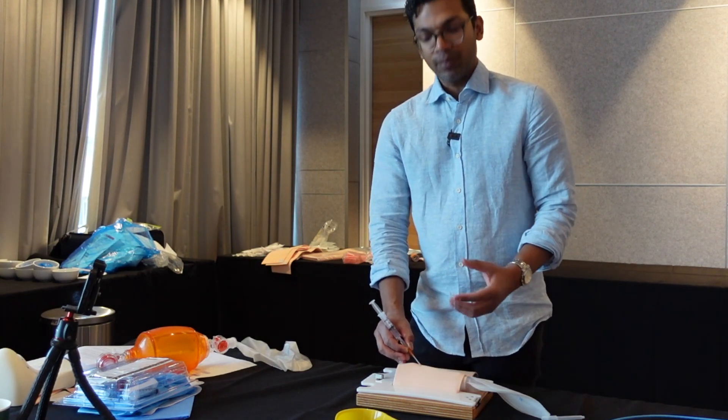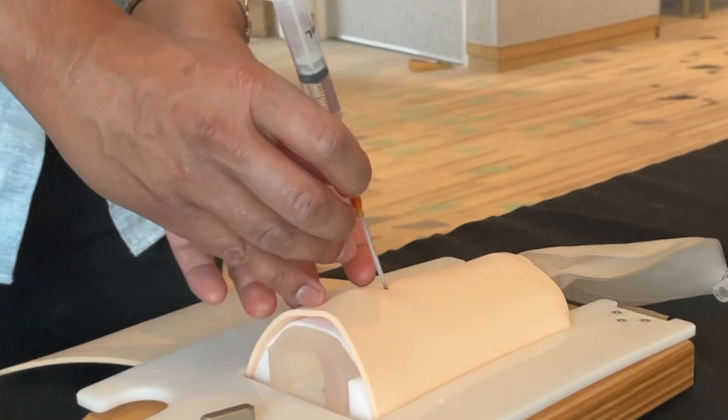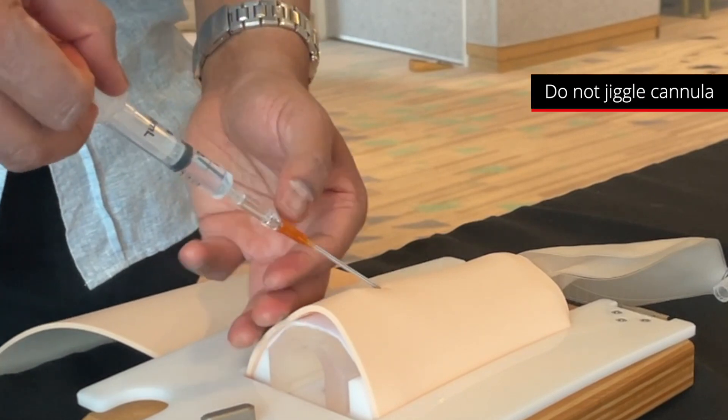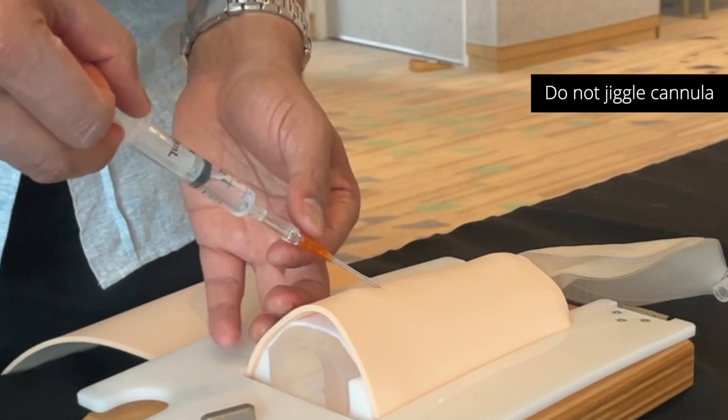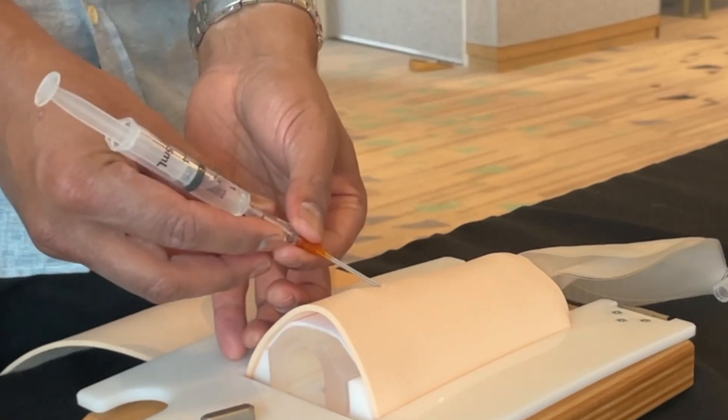If you have a deep neck, you may need to go to a steeper angle just to reach the trachea when the neck tissue is very large. Another mistake is jiggling the cannula back and forth during insertion, as that can cause a disconnection between the needle and cannula, causing a false aspiration of air.